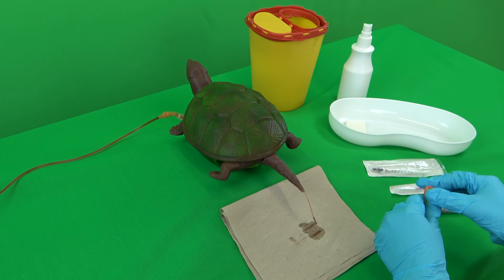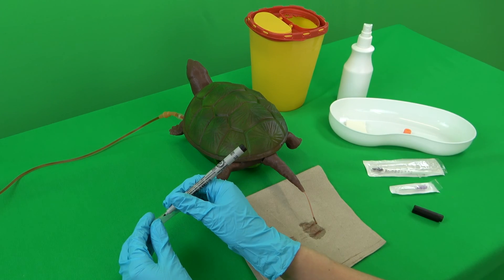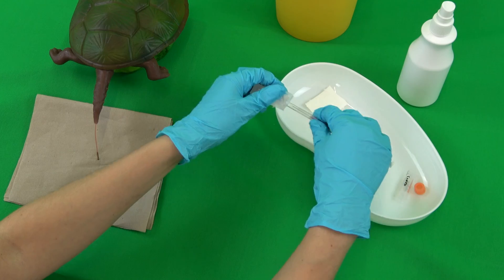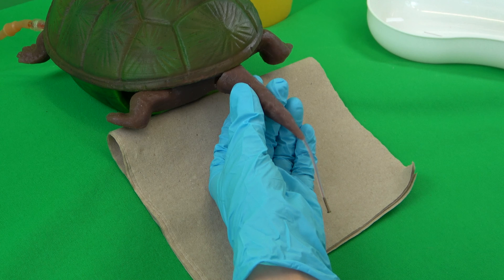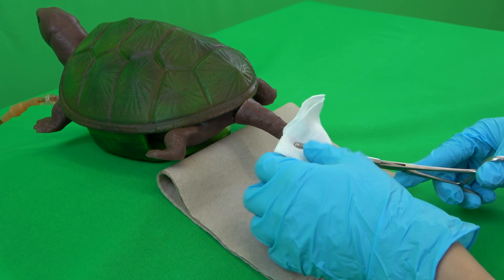First, all required materials are placed within reach. Cellulose is laid out as a base. The sample container is labelled, the syringe and cannula are unpacked, and the cannula is placed on the syringe. The turtle's tail is then held with the thumb and the index finger of the non-dominant hand. For fixation, the tail is gently pressed against the plastron. However, if it is difficult to grasp securely, for example due to a longer supracaudal shell, an intestinal clamp can be used for fixation.